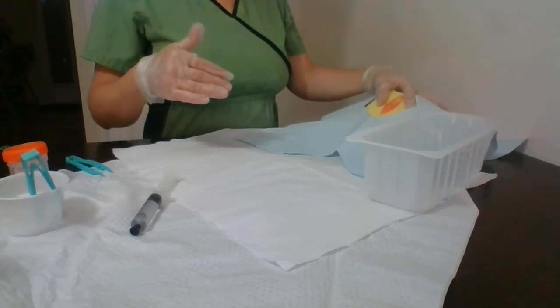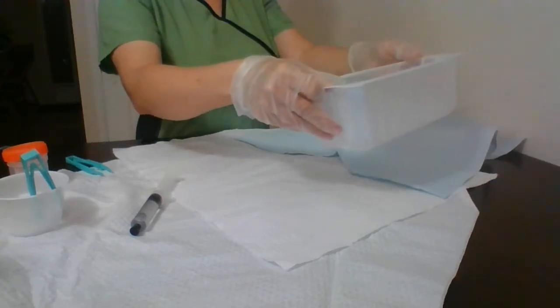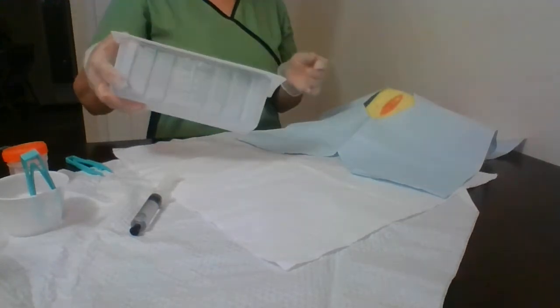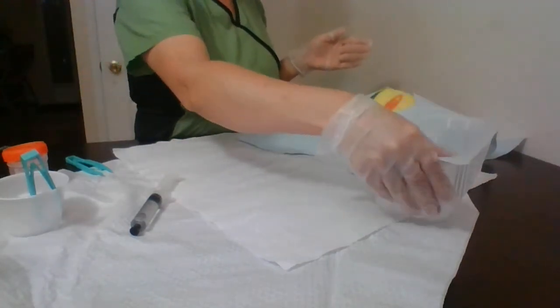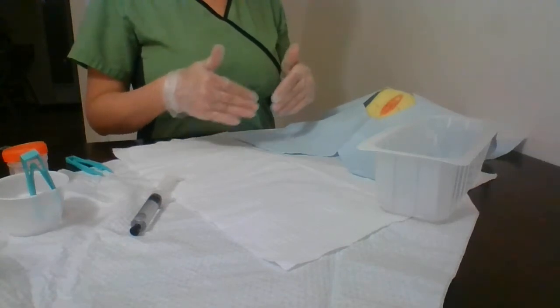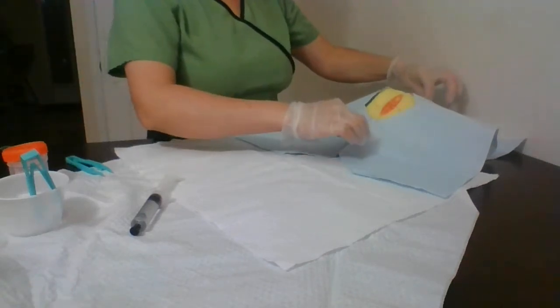In the meantime, I can check the urine that I have collected. What I will do is pour it into a graduated cylinder. And then we will need the measurement for charting for the patient. So right now I will quickly clean my patient.